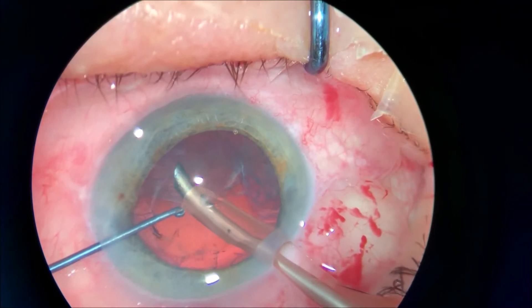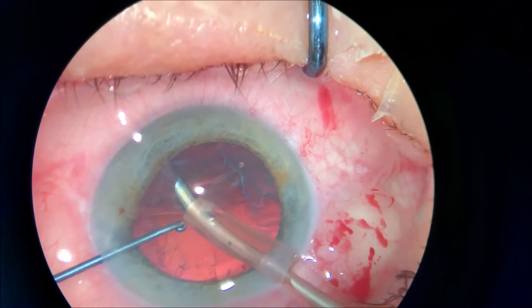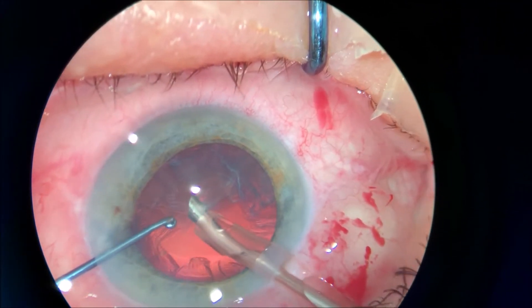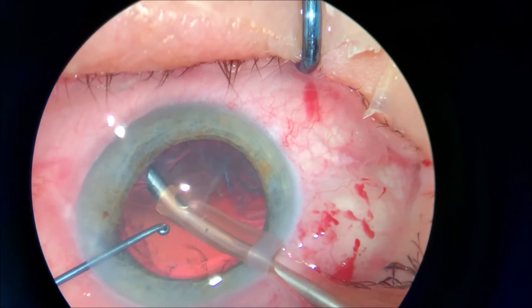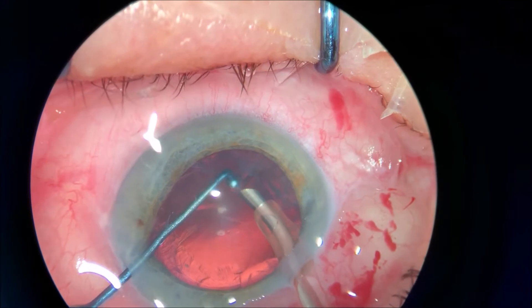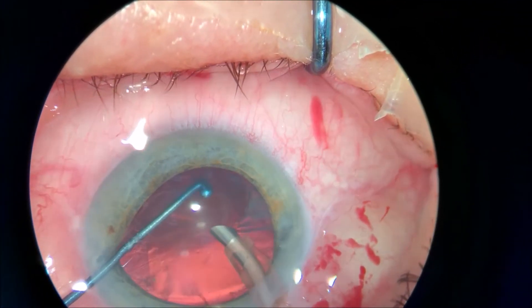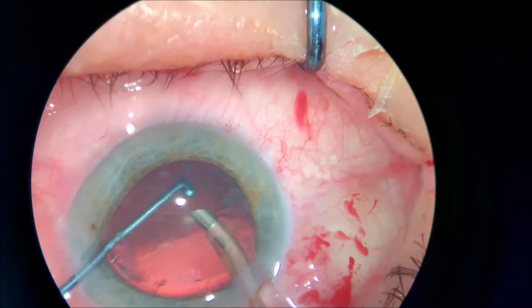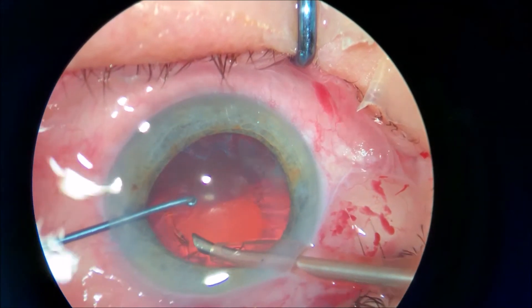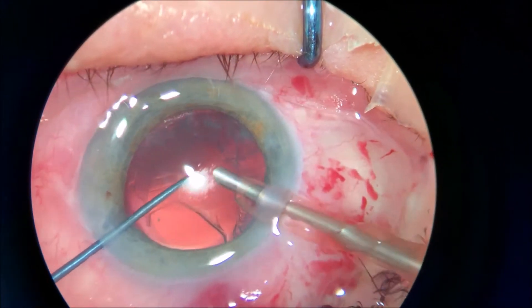Going in and back and forth with the instruments will damage the cornea regardless of how nicely you construct the incision and regardless of how nicely you move your instruments. So having the FACO probe aspirating the cortical remnants inside the bag, instead of going out and going in with different instruments, is preferable.